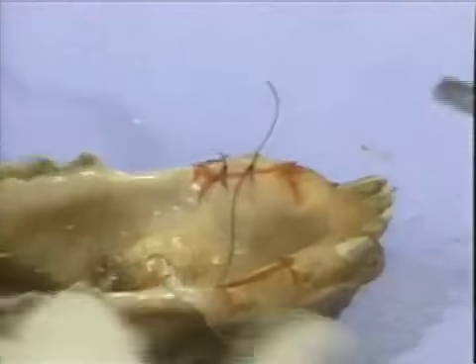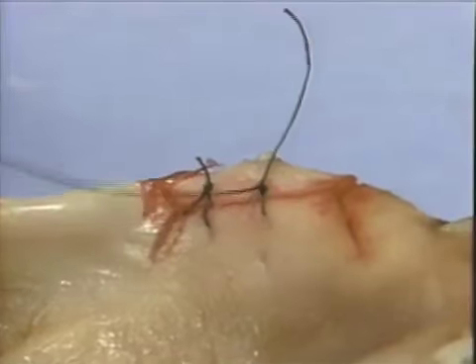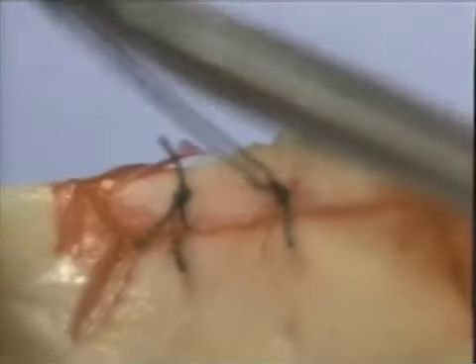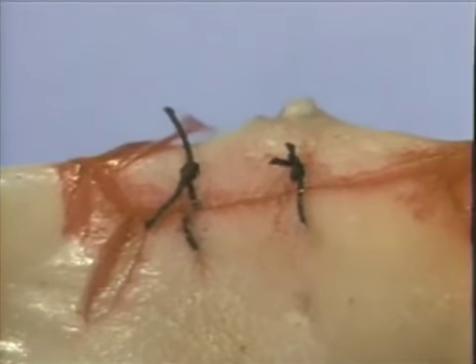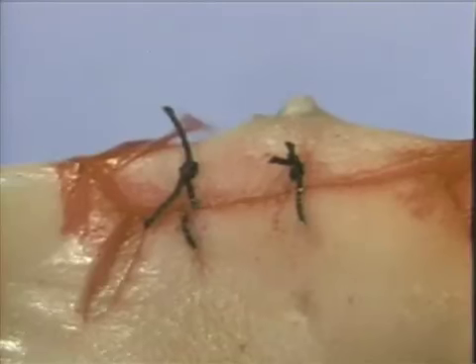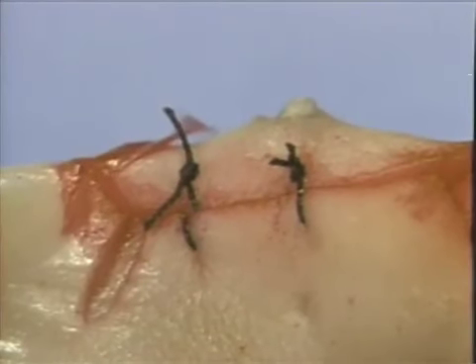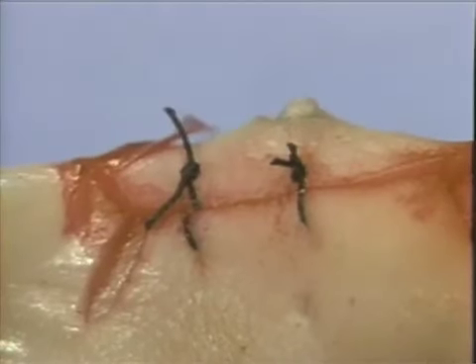The knot should lie either buccal or lingual to the incision line and can be cut approximately 3 millimeters from the knot itself. Here we can compare the interrupted loop suture on the right with the figure 8 suture on the left. The interrupted loop suture allows primary adaptation of the buccal with lingual flap.